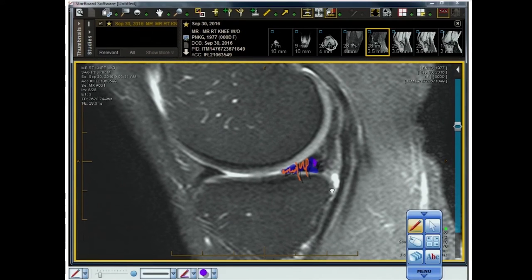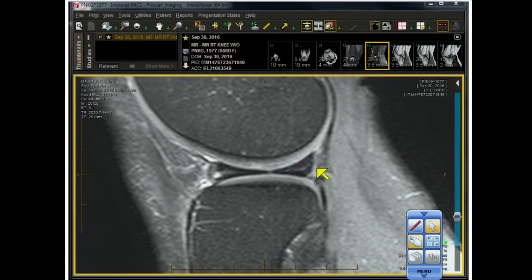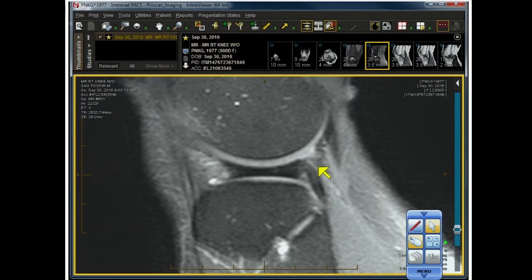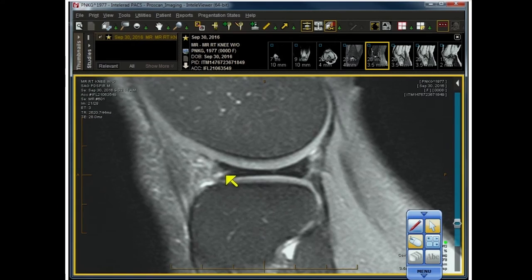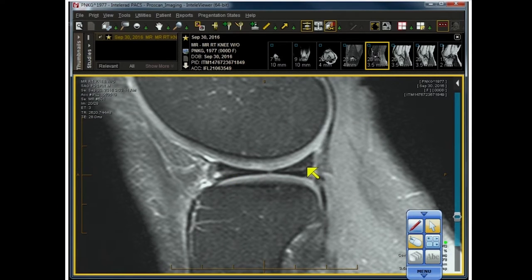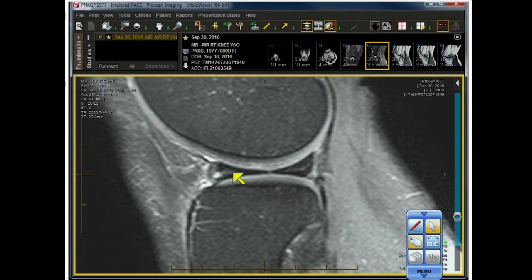Let me convert back for a minute — it isn't quite equal; it starts to faint in the middle third, so that phenomenon isn't very well illustrated here. But believe me, this tear is communicating all the way to the front. You might say there's a tear here and a tear there and maybe they're not connected — but that's silly. You've got a big giant tear that's the same shape as the one in the back; of course they have to be connected, even if you don't see it. It's just common sense.